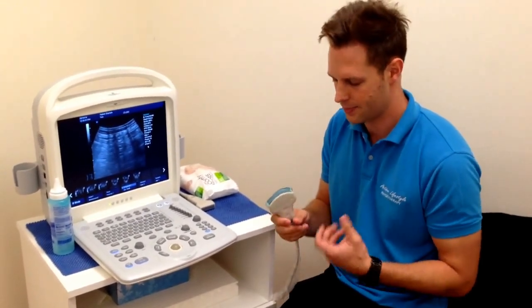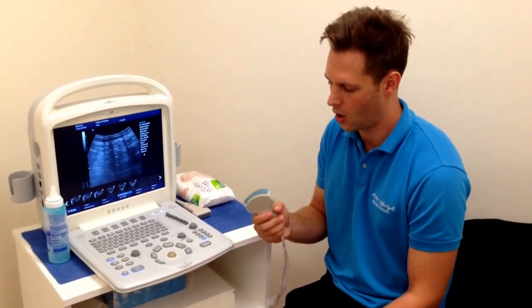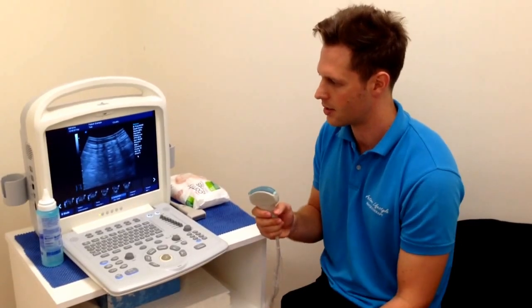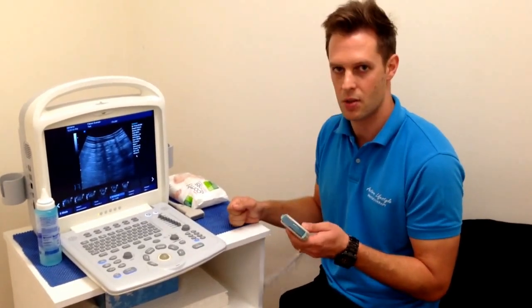Different materials are going to reflect ultrasound waves in different ways. With air, we don't get any reflections, so we don't get any image. So as soon as we put this acoustic ultrasound gel on there, we can start to see a bit of an image, and that's important for transmitting the sound waves into the body as well.